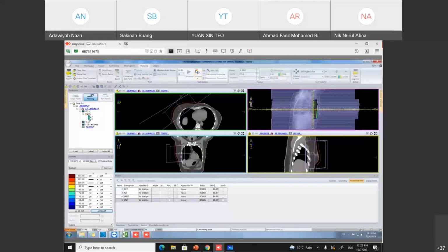The bolus effect increases the surface dose, which is useful in some situations where the tumor is more superficial. We know that for 6 MV the Dmax is 1.6 cm. So how about at 1 cm depth or 0.5 cm depth? It will definitely be less than 100%, maybe a 50% dose.